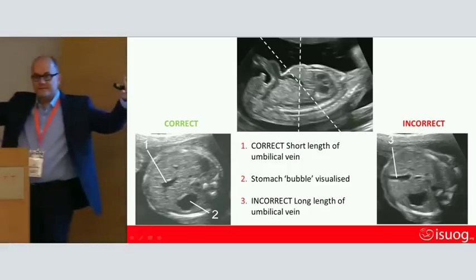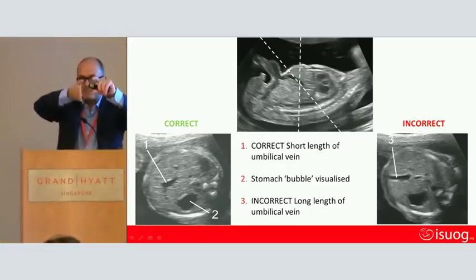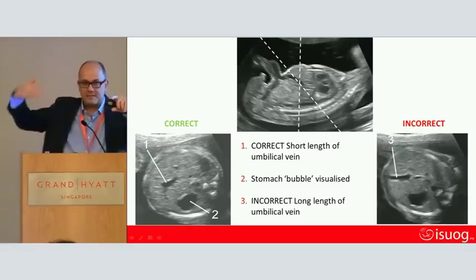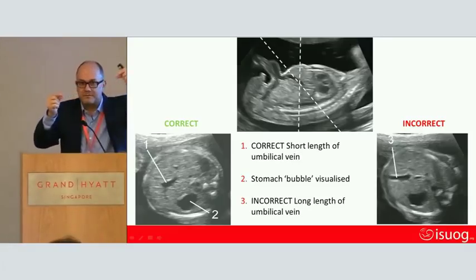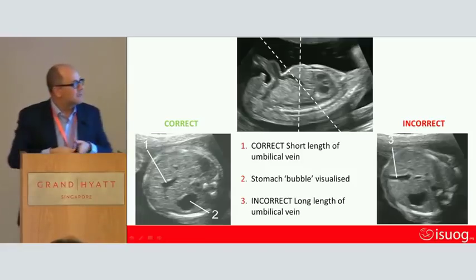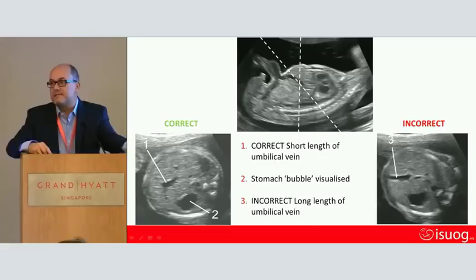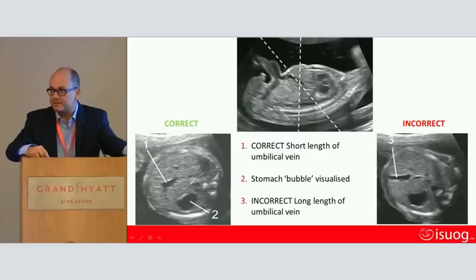Imagine a salami. If you slice the salami at right angles, you get nice little round ones. If you slice the salami across, you get long strips, yeah? That's exactly what happens. So there we have the basic fetal measurements: head circumference, femur length, and abdominal circumference. Have you got any questions on the basic fetal biometry? Good. So we're using HC and femur length here for estimation of gestational age.